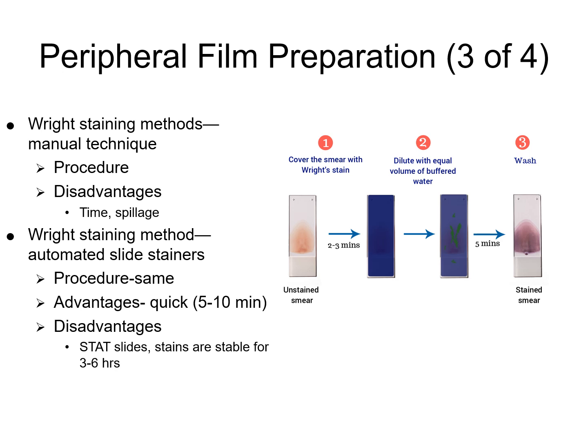Some disadvantages: the stains in automated systems are typically stable for only 3 to 6 hours, so it requires frequent replacement of those stains. The initial cost of equipment and maintenance may be high as well, and it also has limited flexibility for customized staining protocols.